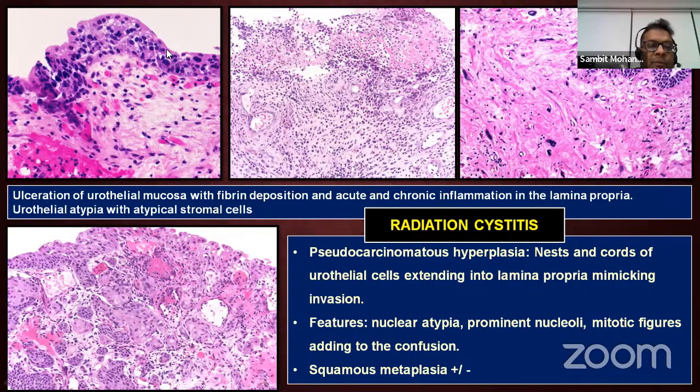What is very evident here is that the cell layer thickness is not increased. They are probably four, five, six layers. But abruptly, you have these bigger cells coming in between the normal urothelium, and they have a syncytia with a cell-free zone, just cytoplasm. And some intracytoplasmic, like the way you see in skin, there is spongiosis or intraepithelial edema. Just below this, you see congested vessels and a lot of fibrin strands with myxoid change and edema.